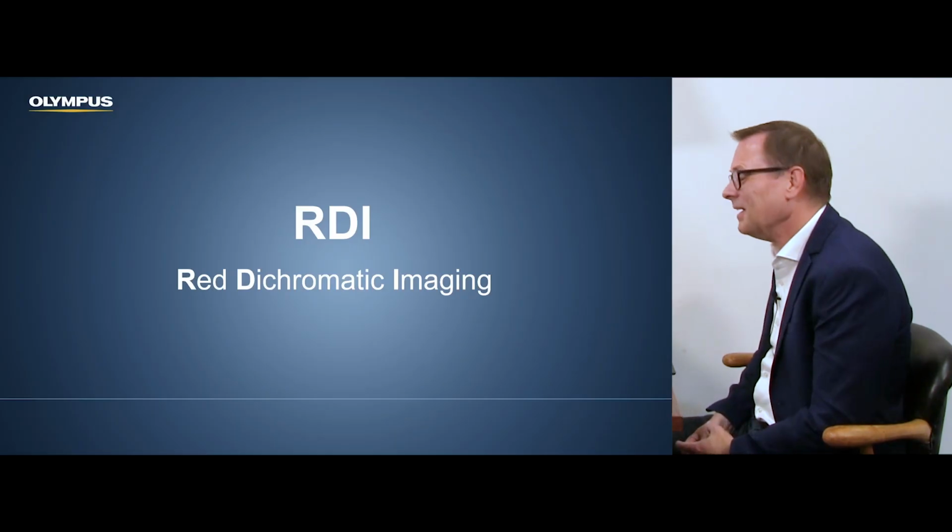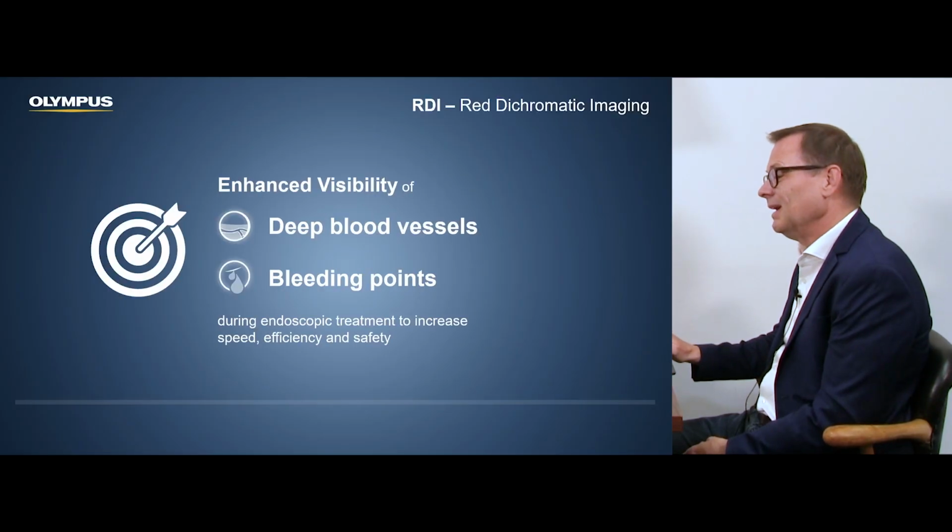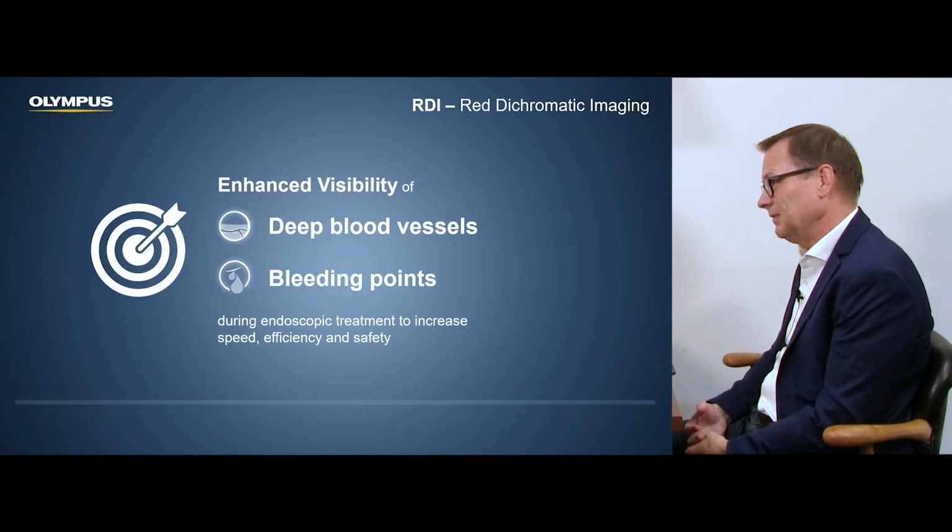Now we're talking about a special imaging which has to do with vessels and bleeding. And again, we have this nice abbreviation, RDI. What's that? RDI stands for red dichromatic imaging, and the idea is to visualize deeper blood vessels.